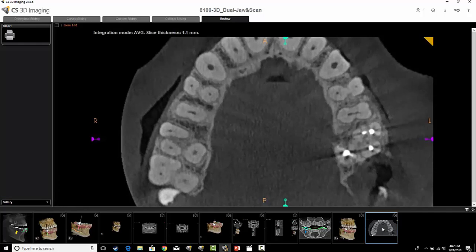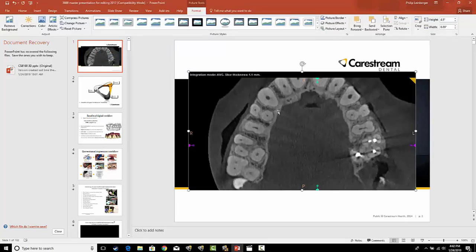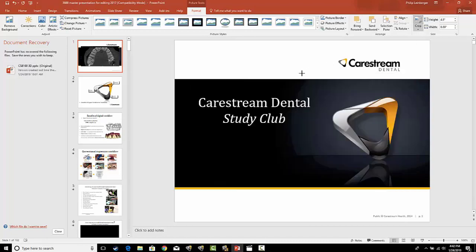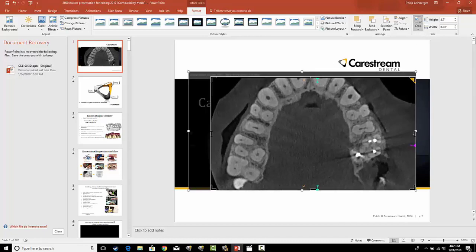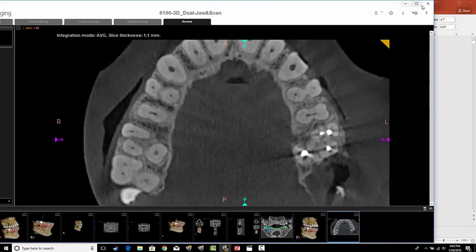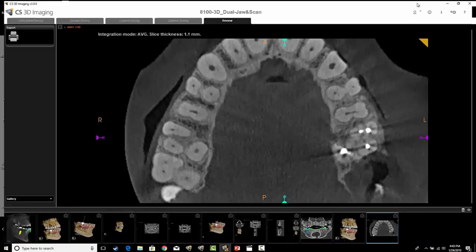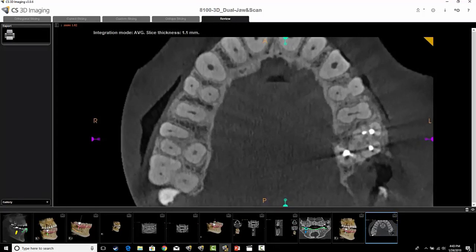Right from the CareStream software, you can drag an image directly into PowerPoint — hold the left mouse button, open PowerPoint, and let go. The image is now inside PowerPoint and you can do normal cropping. You can also restore the window down, grab a screenshot right from the software, and drop it onto the desktop to have the JPEG there. Or you can drag the image directly into an email — a variety of things you can do right from the software after capturing.